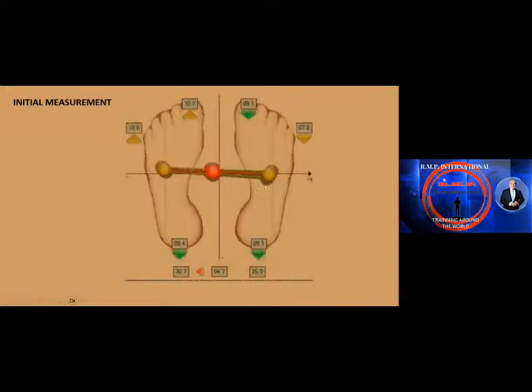And look now at the patient. Initial reading 4.7, yeah? The overload to the left, side deviation to the left. That coincides with the lateral deviation of the jaw.